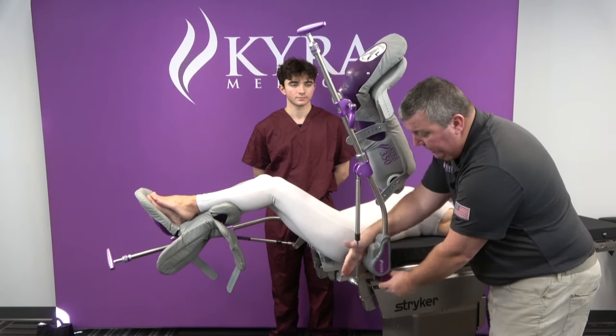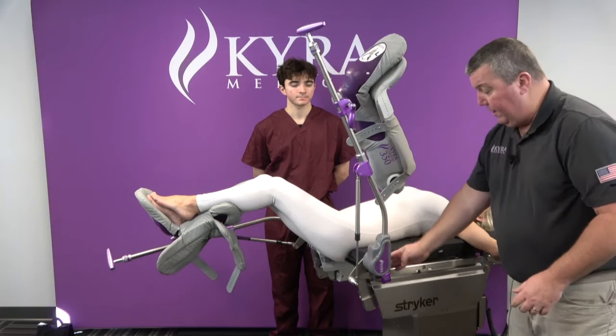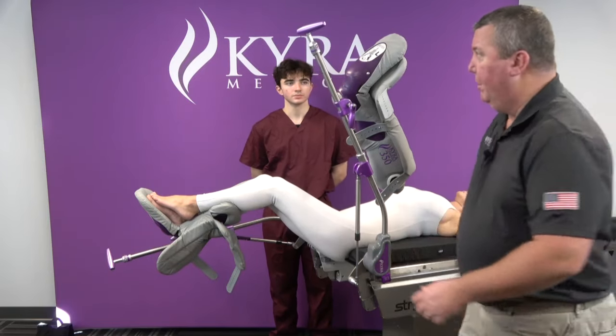If this piece sticks out beyond the rail, that's not a problem. You just want to make sure that the clamp is secured to the rail and that the stirrup blade is into the blade clamp.